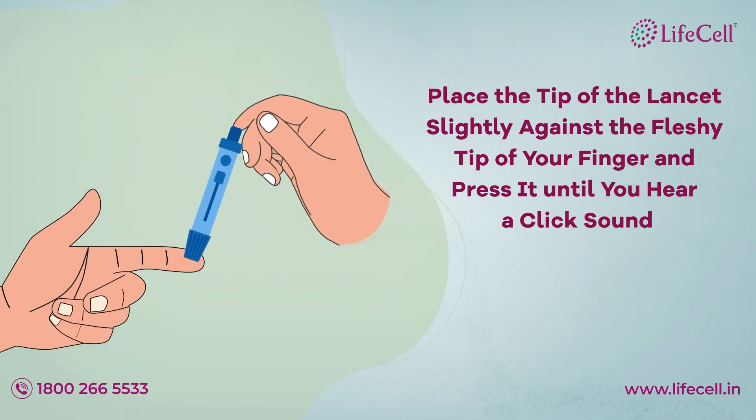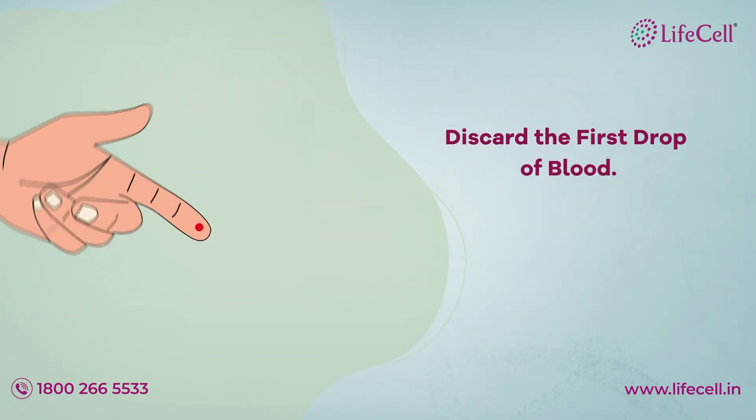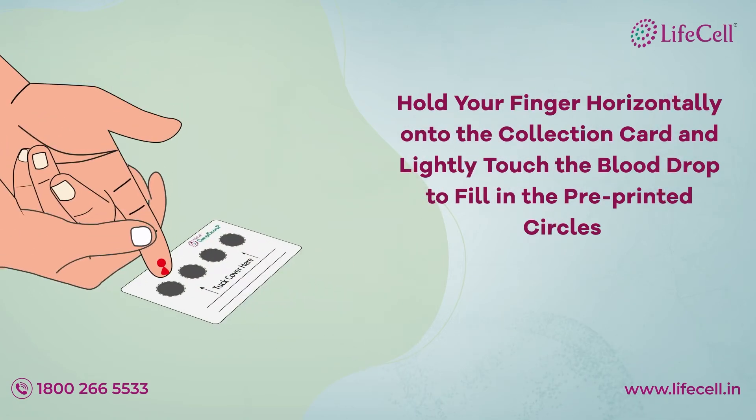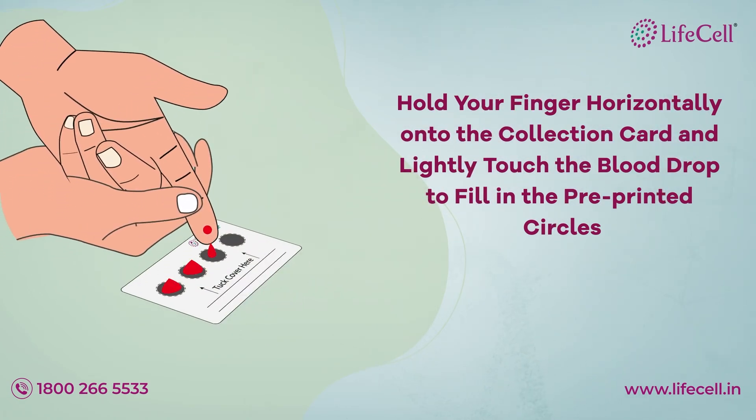Place the tip of the lancet slightly against the fleshy tip of your finger and press it until you hear a click sound. Discard the first drop of blood. Hold your finger horizontally onto the collection card and lightly touch the blood drop to fill in the pre-printed circles.